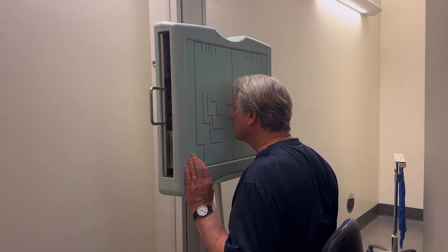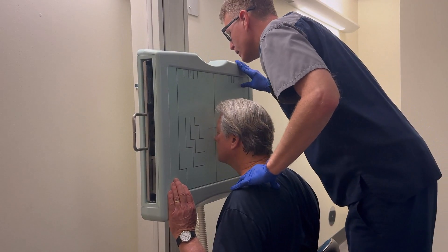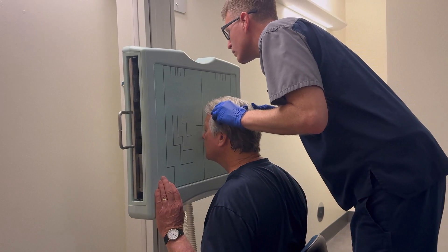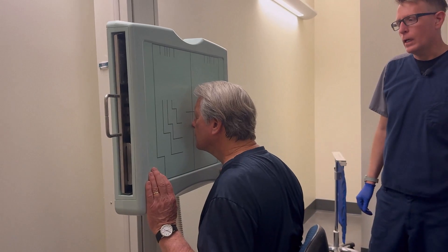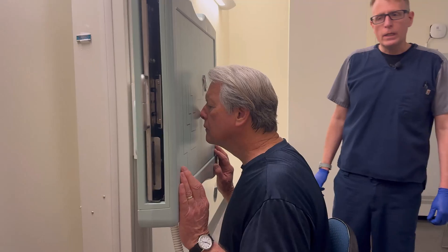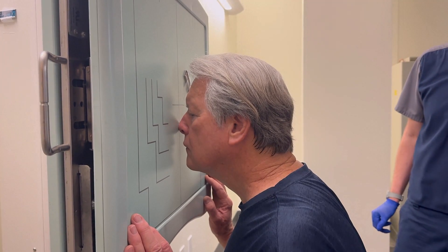You don't know how big your patient's frontal sinuses are at this point. I'm going to look overhead, pull you back slightly, move you over, and then touch in. Just have your patient hold very still and expose on suspended respiration. This is a PA Caldwell of the sinuses — we have tilted or angled the patient's head rather than angled the tube.